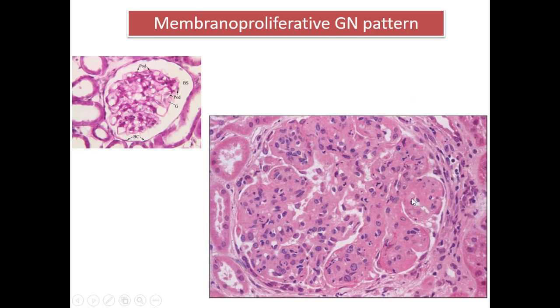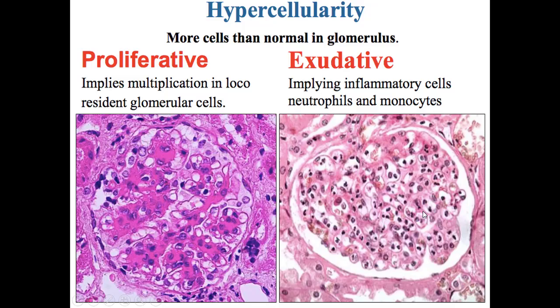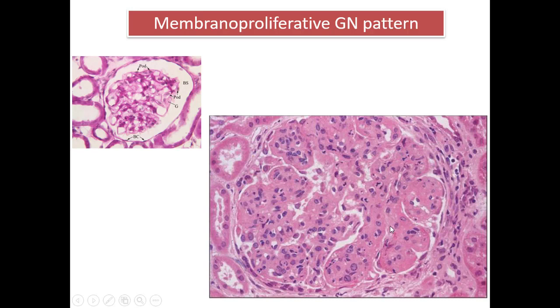This is another type of membrane change accompanied by another change. So here you will see there are very few capillary spaces. Why? Because there is a proliferation of the cells. The cells are too numerous, occluding most of the white spaces, and the mesangium is also increased. This is surely a hematoxylin and eosin picture because we only see cells. You here will find only cells.